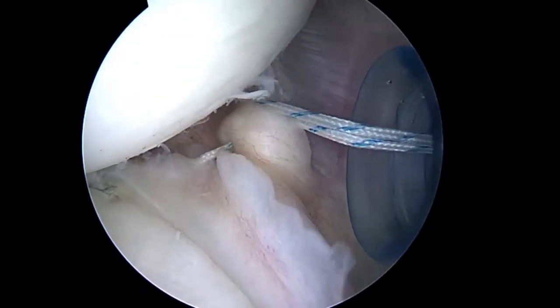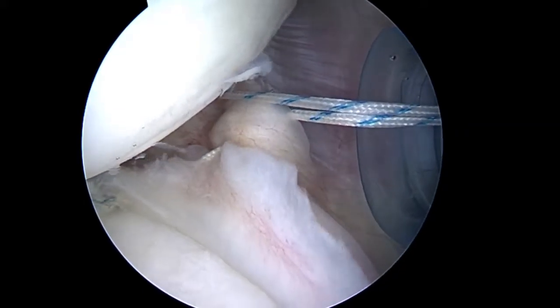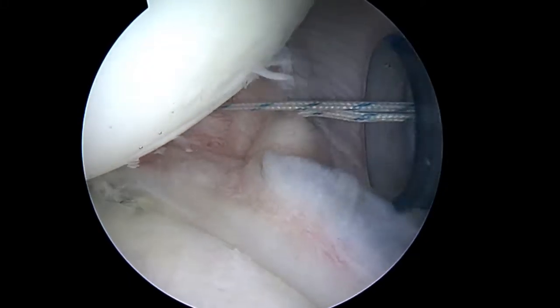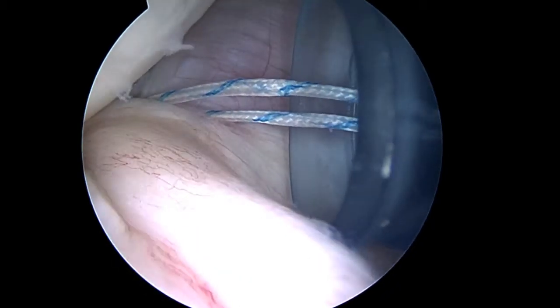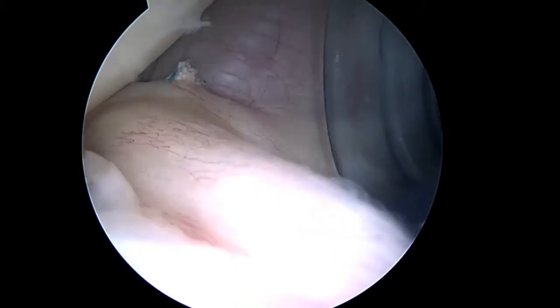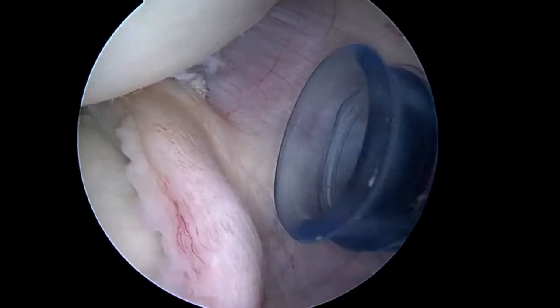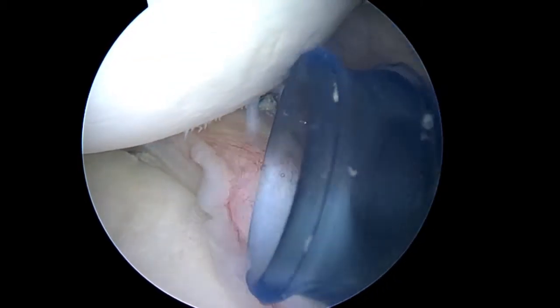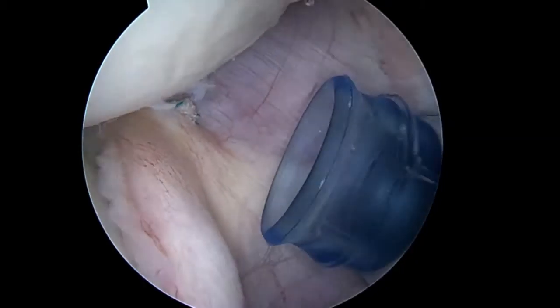We've got both sutures passed. Now we're going to tie a knot here and make sure that closes down this posterior capsule the way we want it to. We're going to go ahead and put the suture tails on the first knot — there it is. The decision we've got to make is do we tighten up a little bit more, and I think I am going to. I'm going to place another anchor here — even if we just do a simple stitch — just because the primary direction of your instability really seemed to be posterior.